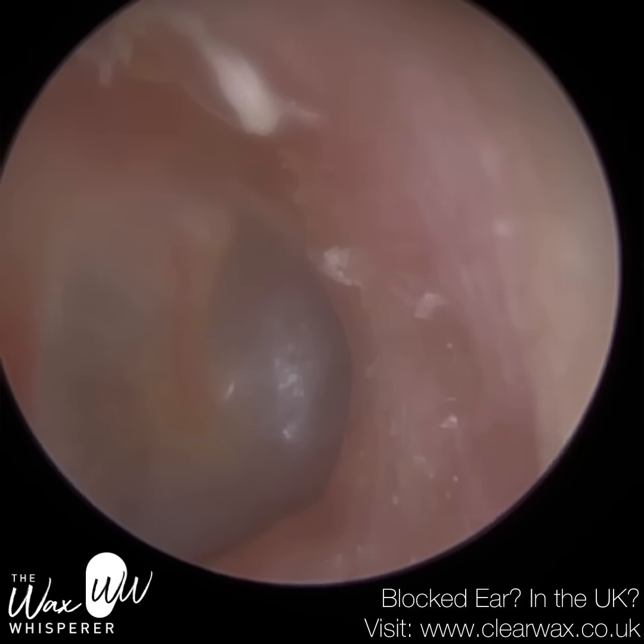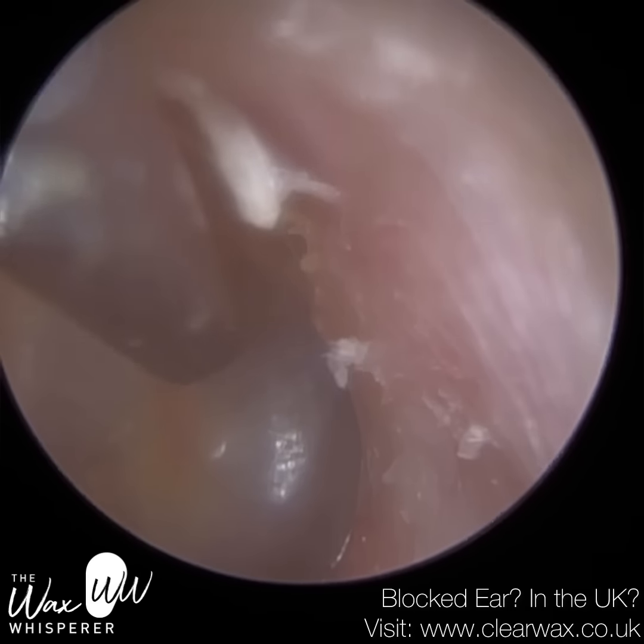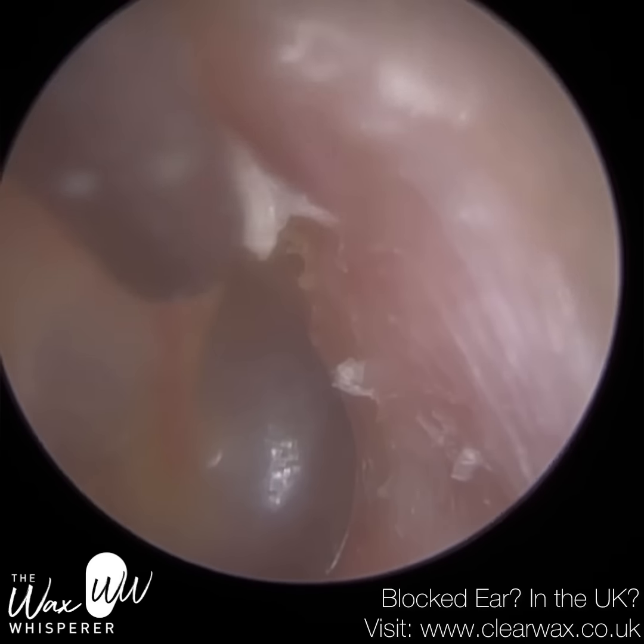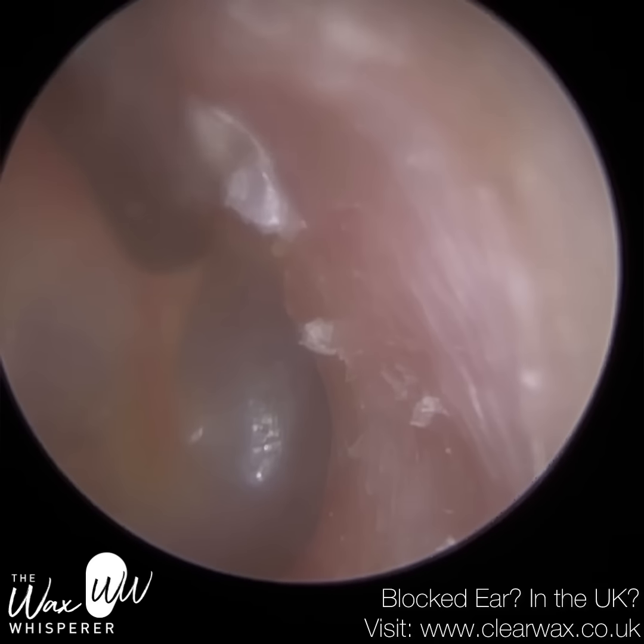Okay, so I'll go back to the video, guys. So we've cleared all that debris. I'm giggling because I've just talked about the ear. And, as you can probably tell, I really am passionate about what I do. I enjoy what I do.